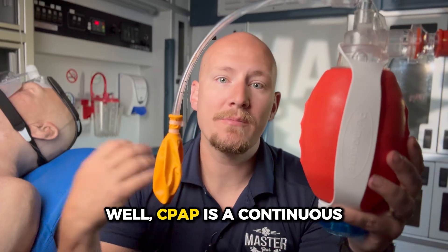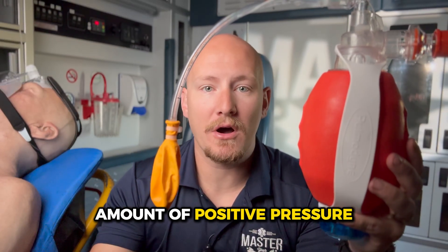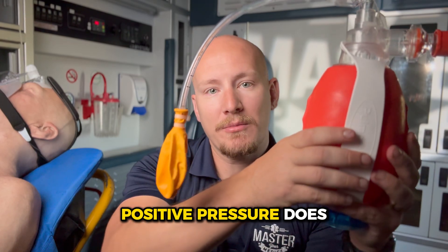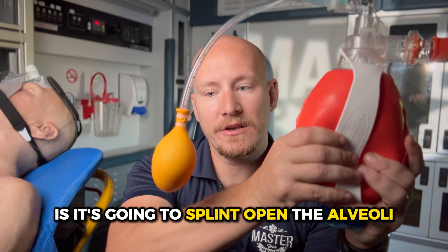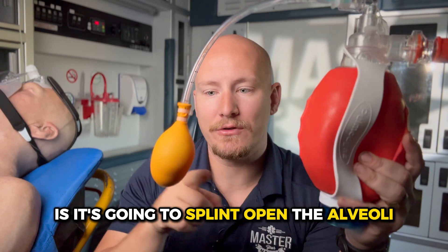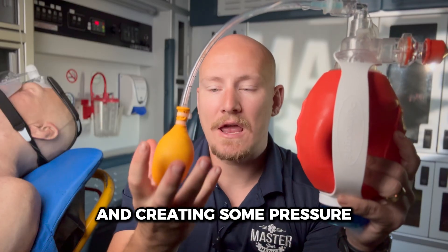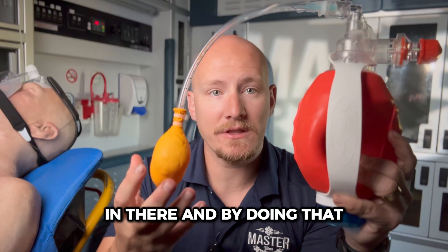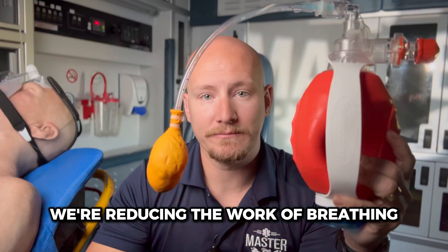So how does CPAP work? CPAP is a continuous amount of positive pressure. What that continuous positive pressure does is splint open the alveoli — as you're seeing here — creating pressure inside them. And by doing that, we're reducing the work of breathing.